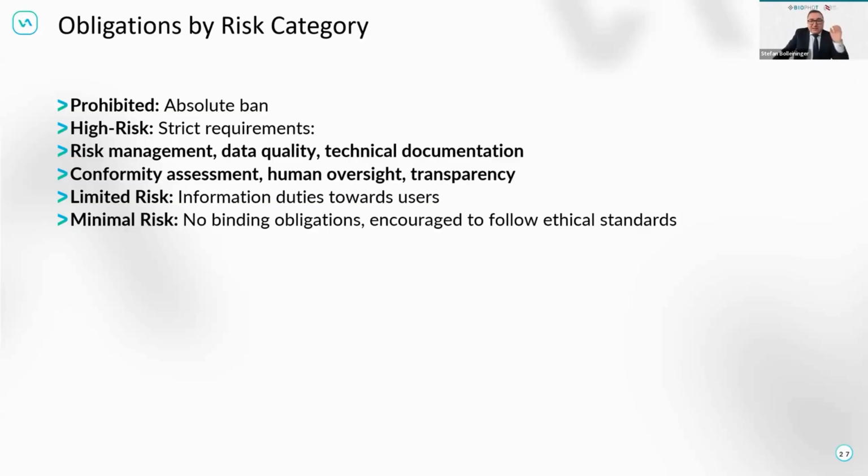Okay, so there is a question. According to these regulations, where would pre-trained machine learning models fall into, considering that their predictions would be deterministic and the level of autonomy would be minimal?